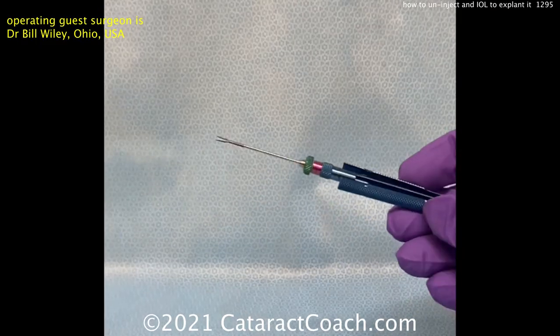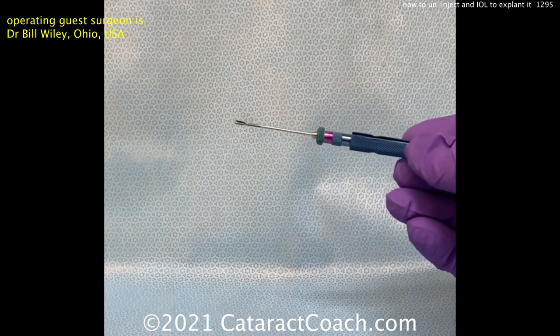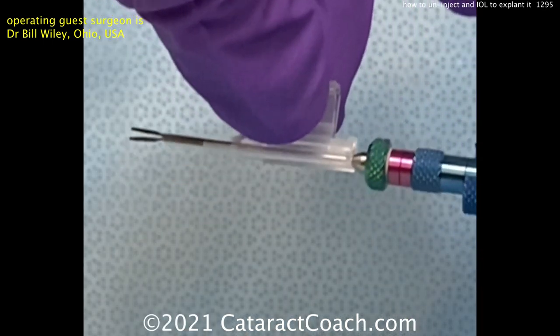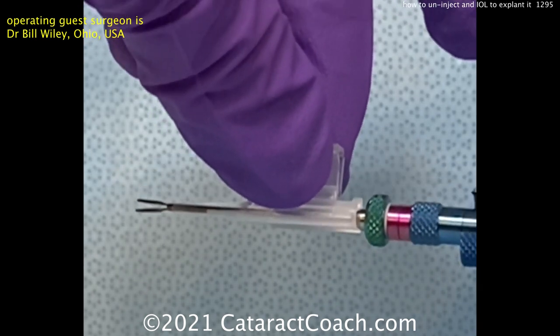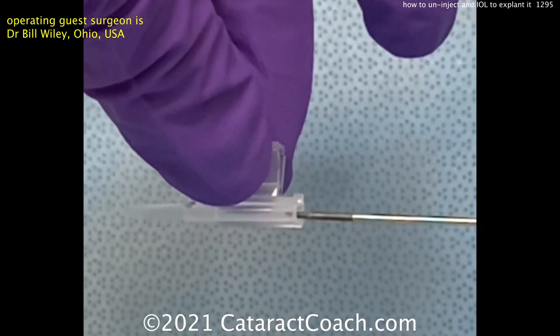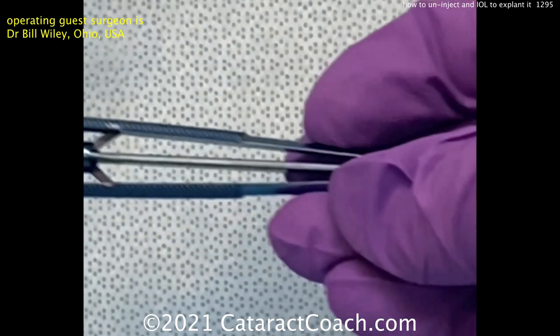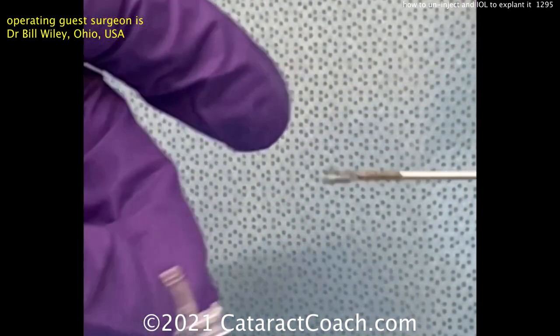Those are the Fuoka forceps, from a surgeon in Japan. The Fuoka forceps go right down the barrel of your injector tube, grab the lens, and retract it. The barrel of the empty injector tip serves as a tunnel to help guide that lens out of the eye.